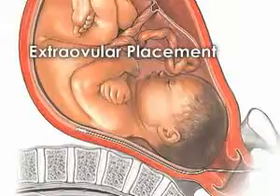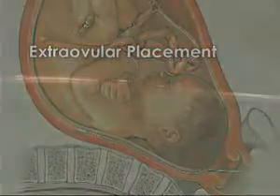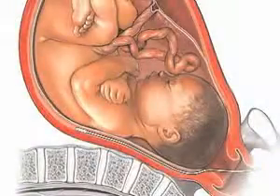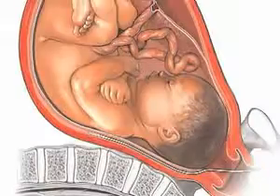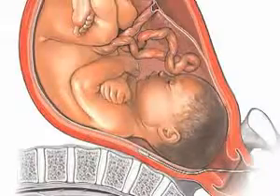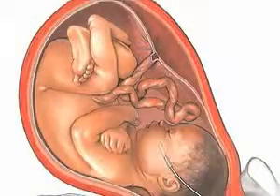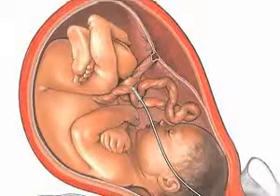For dampened waveforms when extraovular placement is suspected, look for a flashback of frank red blood, more distinct than blood-tinged amniotic fluid, flowing back through the clear catheter lumen. If blood flashback is observed, remove the catheter and reinsert it into the amniotic space, pausing to look for amniotic fluid flowing back through the clear catheter lumen.